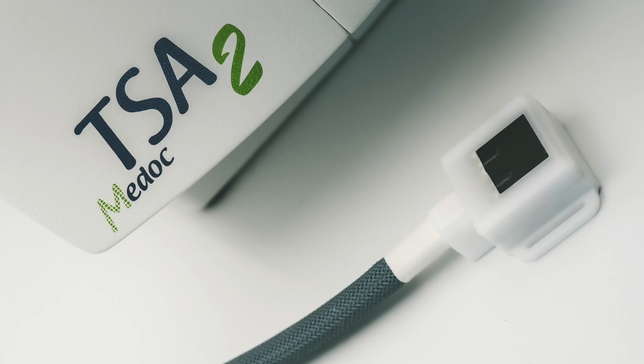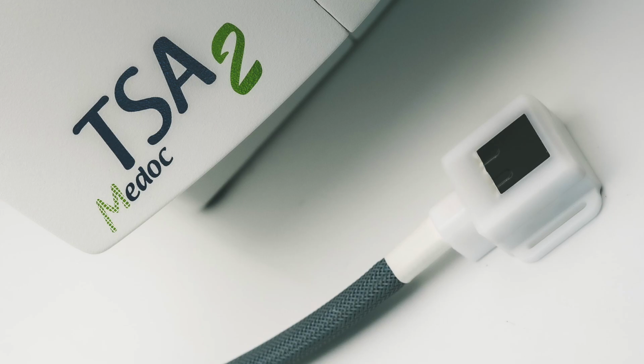So the questions are: is this accessory compatible with the old model? Unfortunately not. This is the accessory for the TSA2 device. The previous Pathway CHEPS has its own CHEPS accessory with its capabilities.